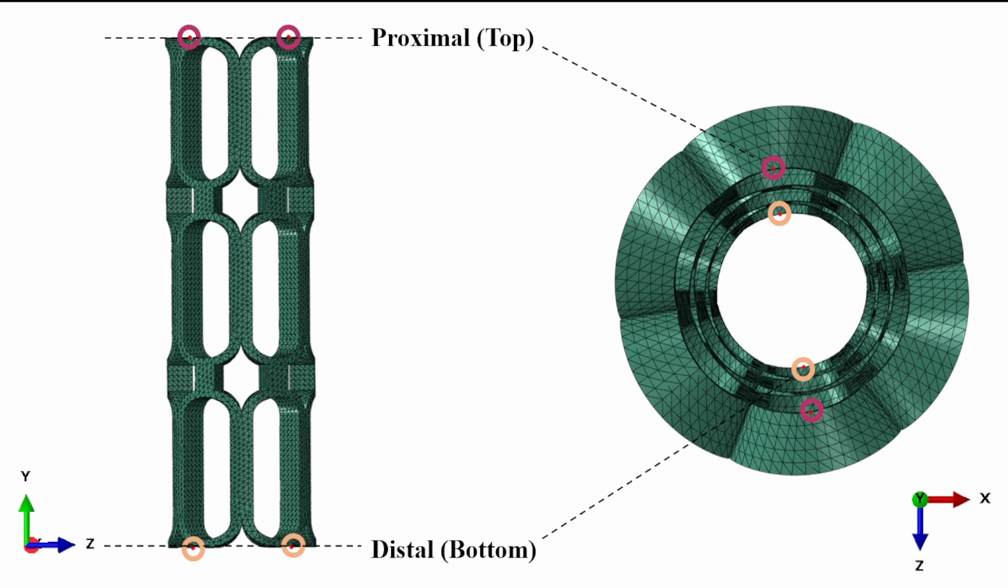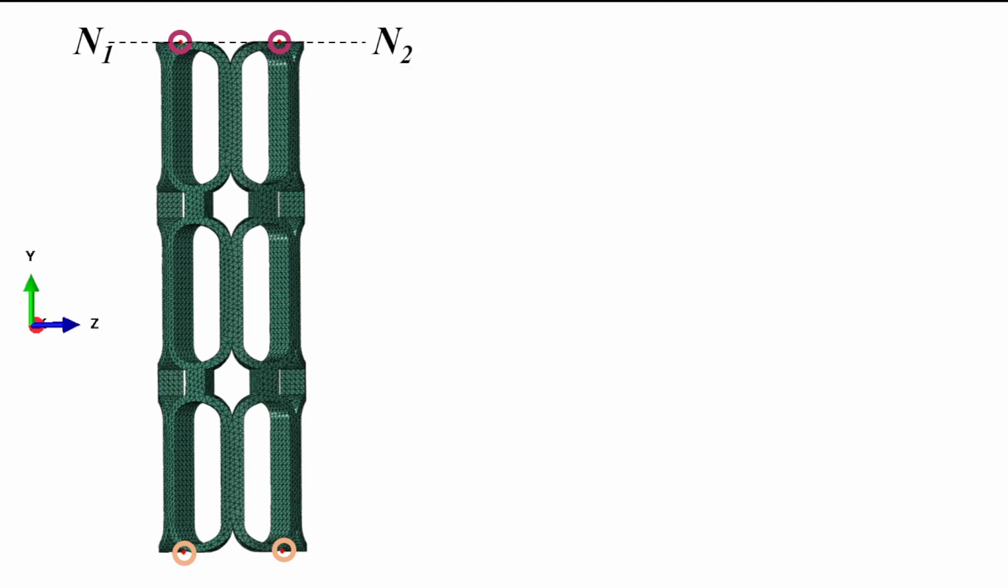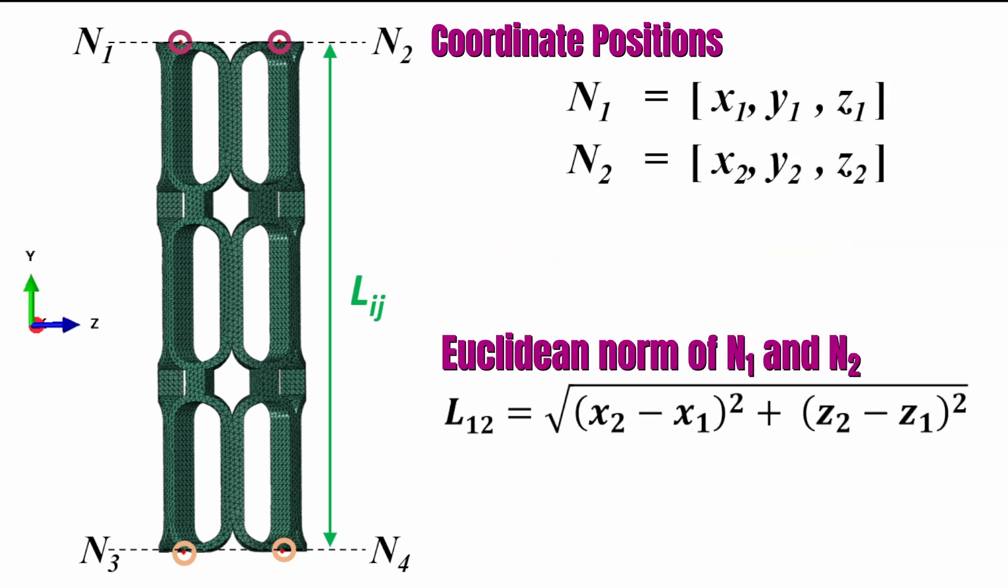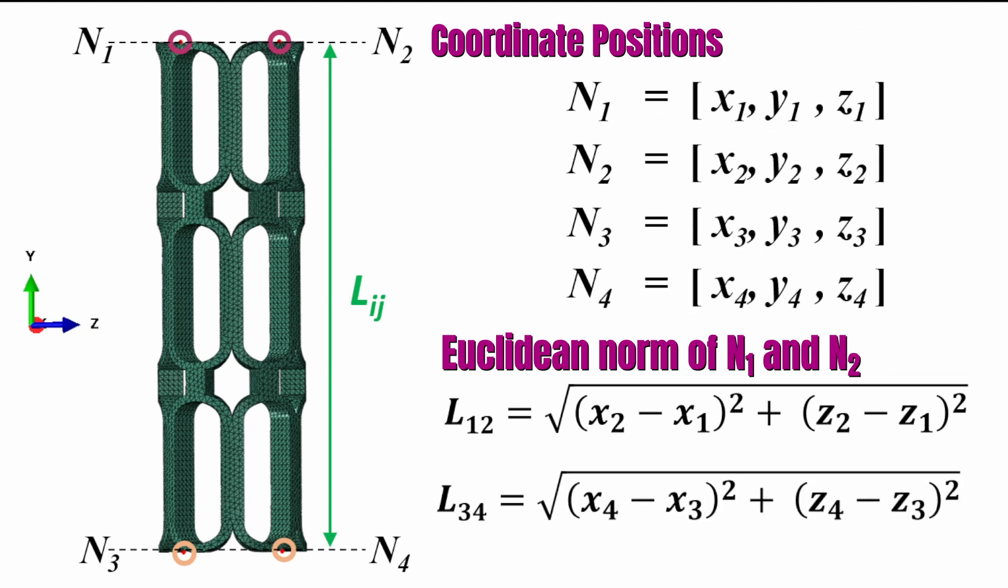Remember, what we're trying to determine here is the longitudinal retraction. So we need to find the total length of this stent and see how much this total length will change during the deformation, and that will lead us to determining the longitudinal retraction. If you look more closely here, I've got node one and node two for the top and node three and node four for the bottom ones. The overall length of that stent will be determined as L_IJ, where IJ refers to the combination between one and two. We'll obtain these coordinate positions for node one and node two, which using the Euclidean norm L_12 = sqrt((x2-x1)^2 + (z2-z1)^2), you can calculate the length separation. We'll also determine the coordinate position of three and node four, and that will help us determine the length of three and four.